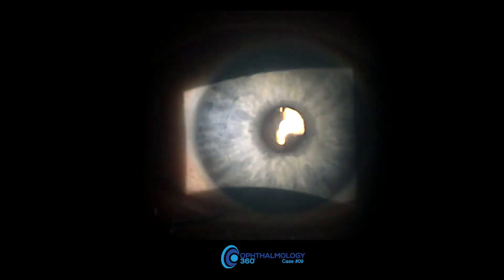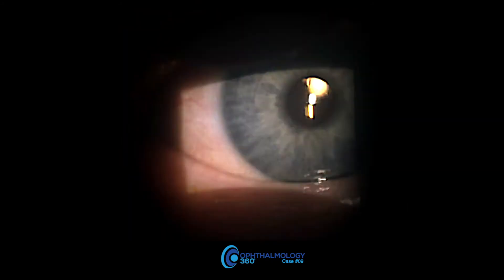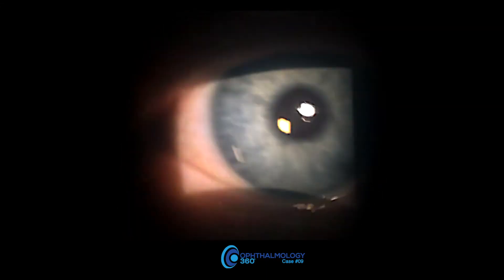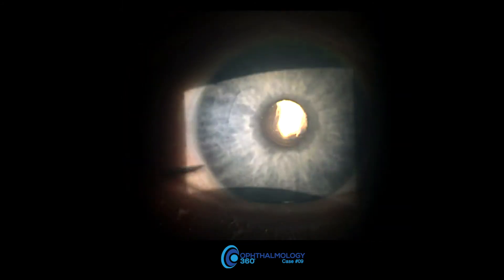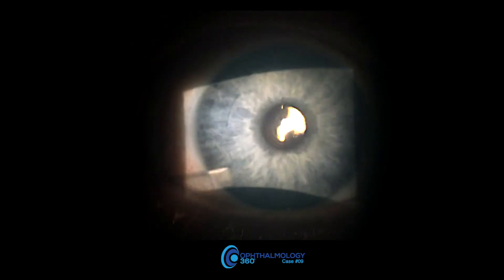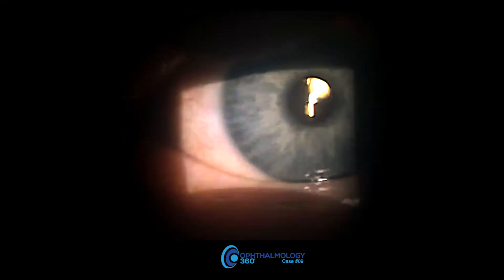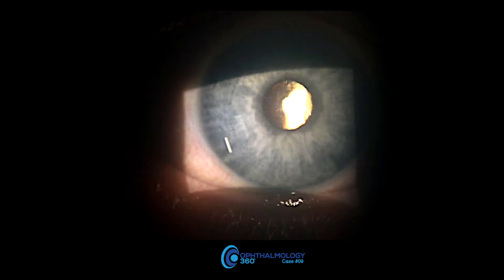Here it is not at an acute angle, but I try to stay below the pupil. And you can see again, sometimes it'll migrate towards the incision site. So here's a pseudophakic patient with an extended depth of focus implant. Most of these patients have had mixed procedures as well, and the point is to try to get them off as many drops as possible. This is not a real acute angle, some more parallel. I'd like maybe to do a little more acute angle if I can, but whatever gets you into the eye comfortably is worth doing.